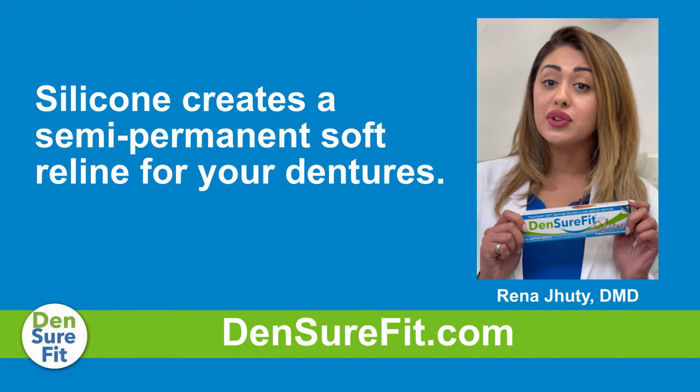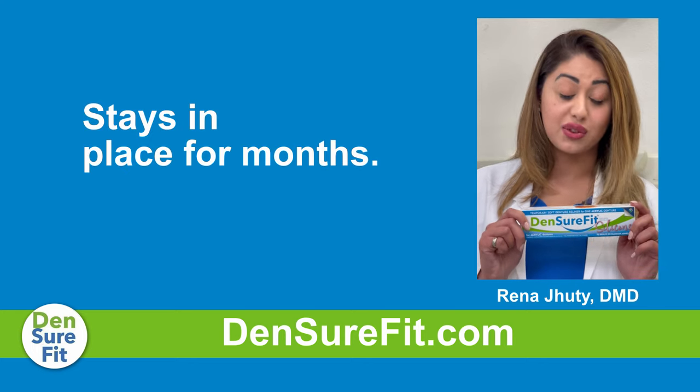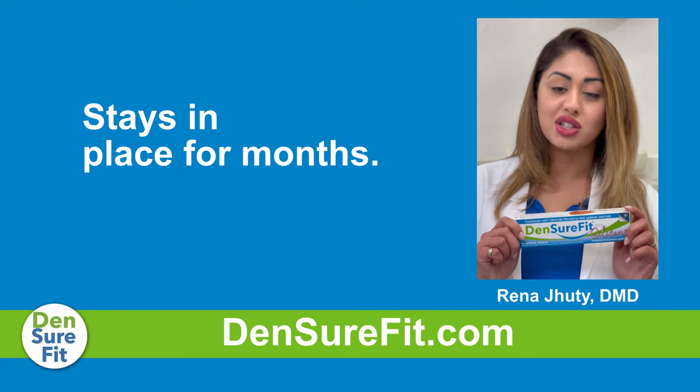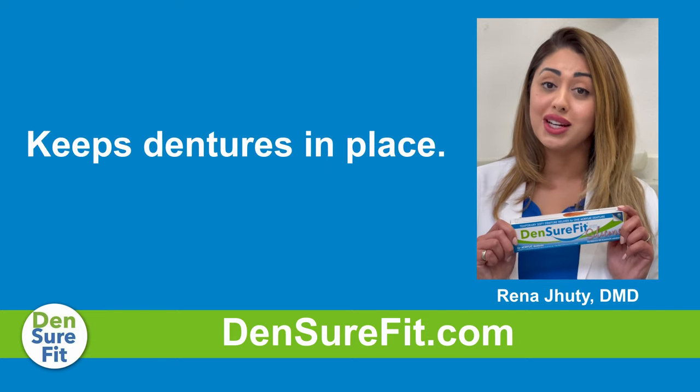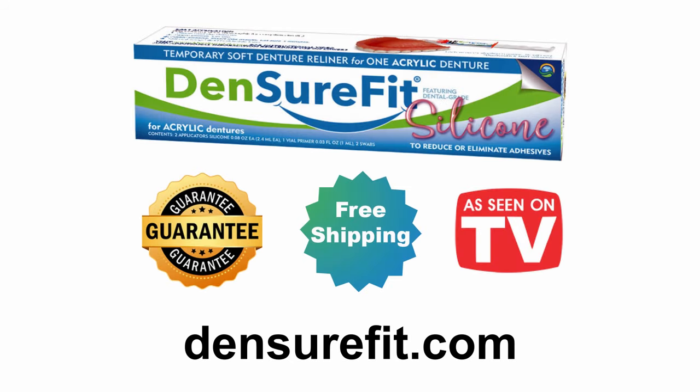The silicone will fill the empty spaces and create a semi-permanent soft reline on your denture that stays in place for months, not days or hours. It provides a soft suction fit that keeps your dentures in place and prevents any food from getting under your dentures. DenSureFit's innovative suction technique will make your denture fit like a glove.